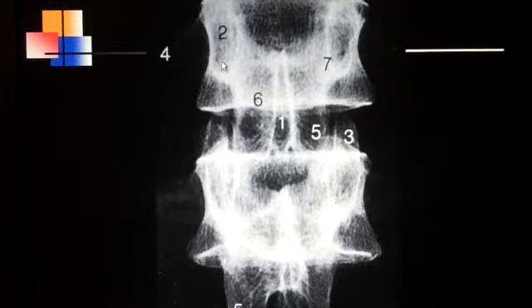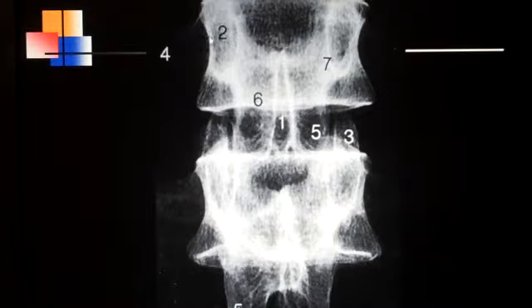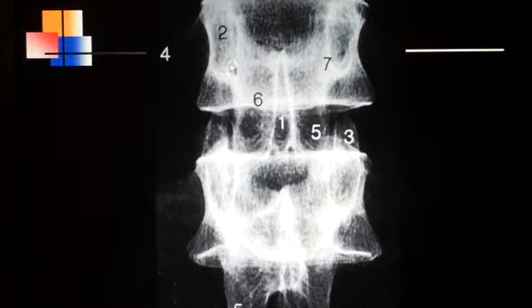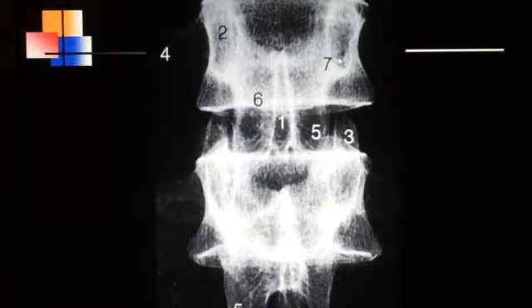Number two is labeling the pedicle. The pedicle is all of this circle right here — on this side and on the other side as well.